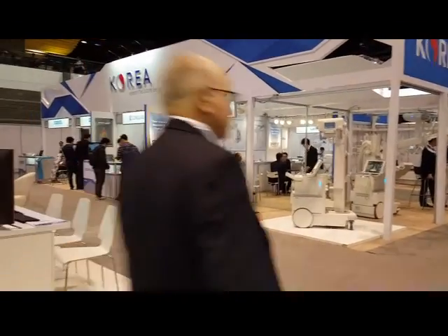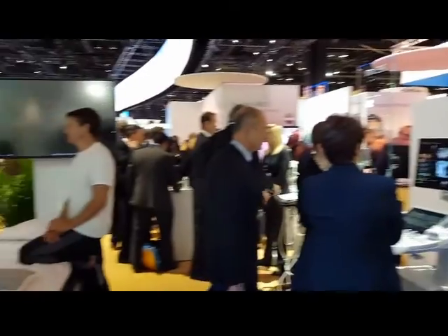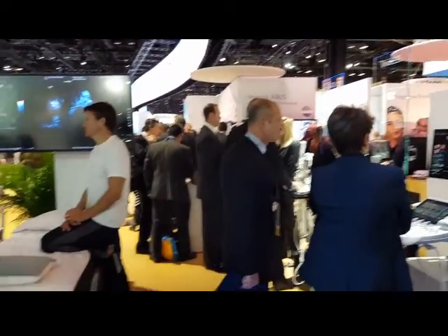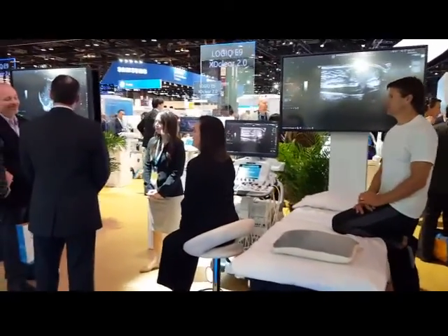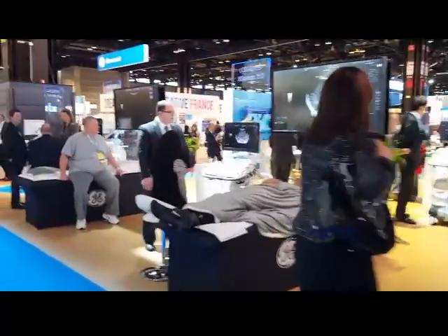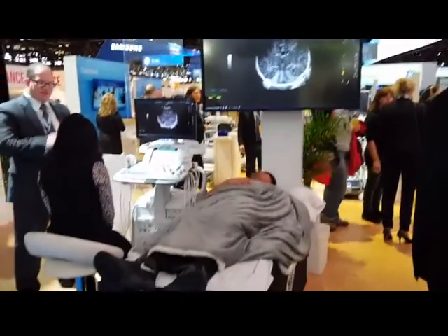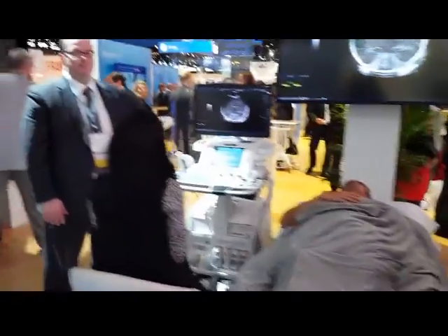There have been a ton of Koreans here — not that you guys care, but I've been pretty impressed. I'm at the GE booth, and there are some MAMO machines back there that were not that big a deal. And then here are some ultrasound machines, which I don't know anything about, but let's just show the ultrasound techs. Those screens up there have to be demo screens — I don't think they come with the unit, but you never know. They even have a guy laying there; I guess they're scanning him.